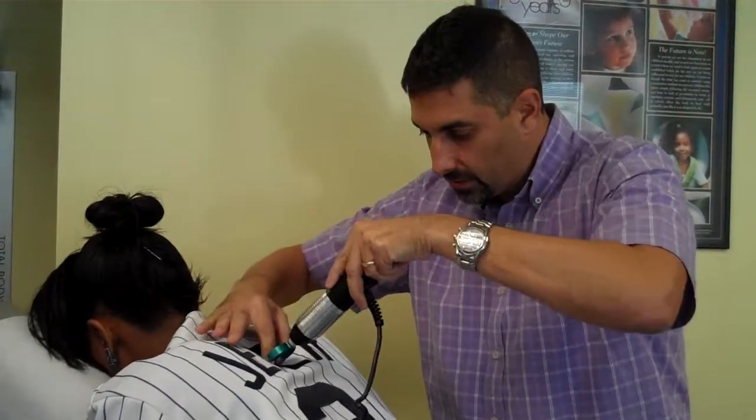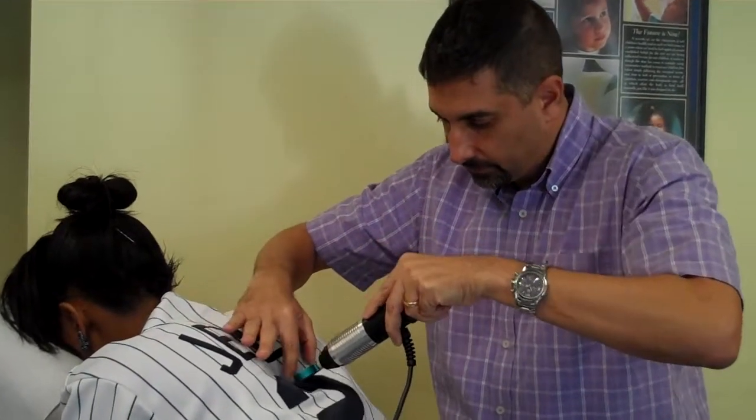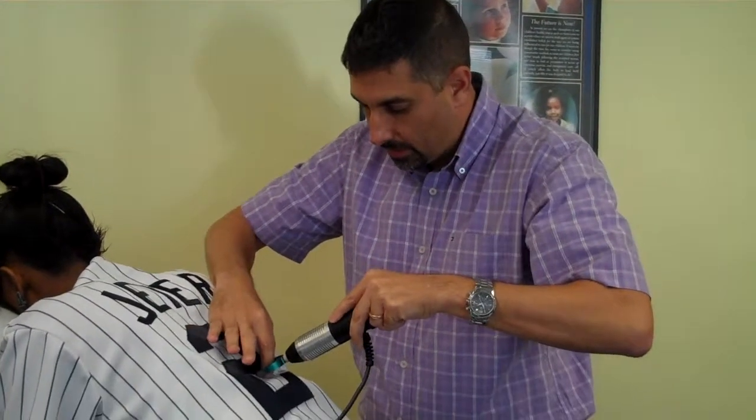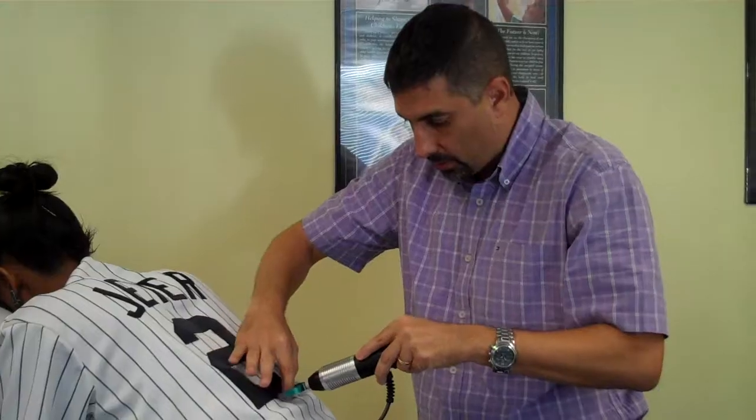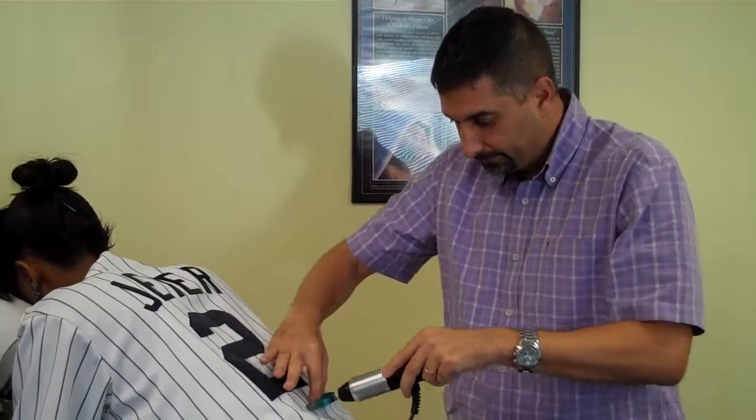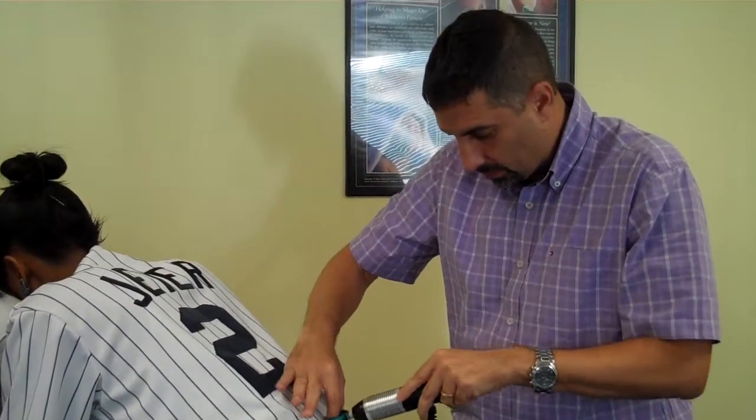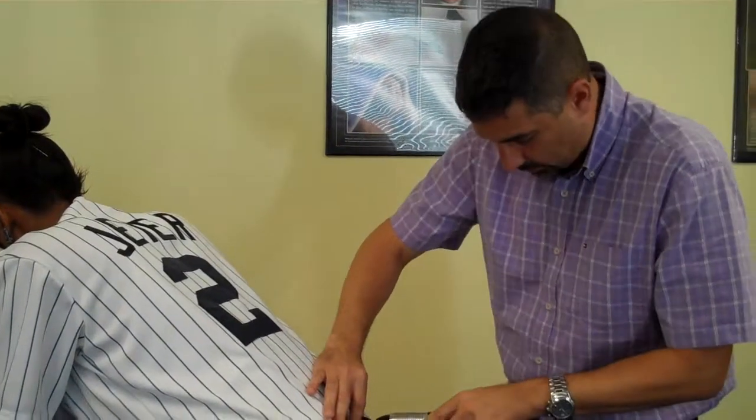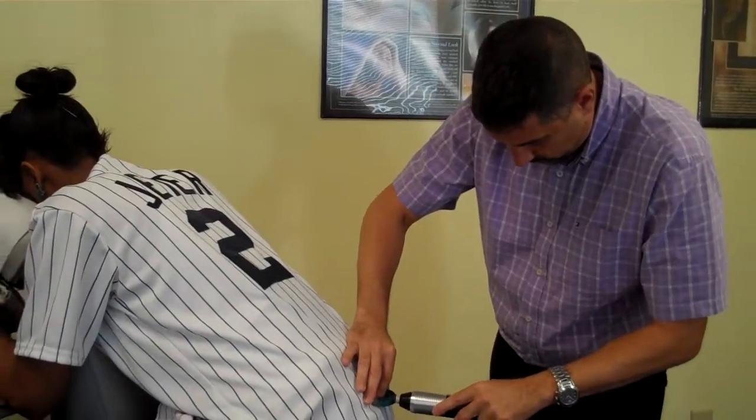Then we're going to go through the thoracic spine, using your index finger to palpate as you come through the spine, into the lumbar spine, and now into the sacral spine.